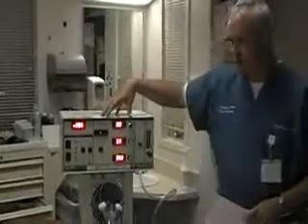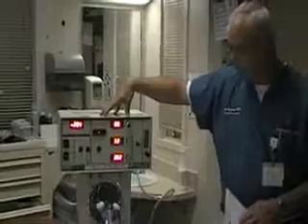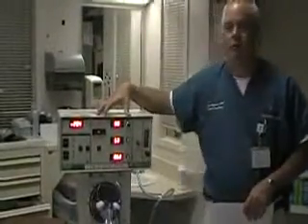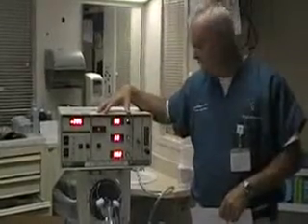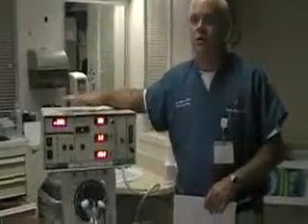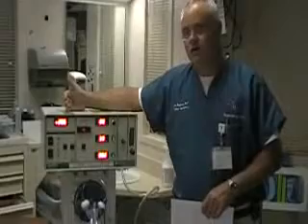We won't be able to do end-tidal measurement on CO2 with the oscillator. The flows are just too high for that. But if you have transcutaneous monitoring available, that's a great way to monitor your PaCO2. So those are some initial things that you can do to transition from conventional mechanical ventilation to the high-frequency oscillator, 3100B.